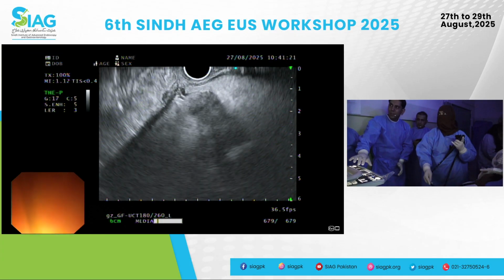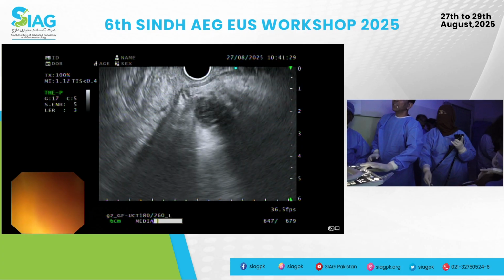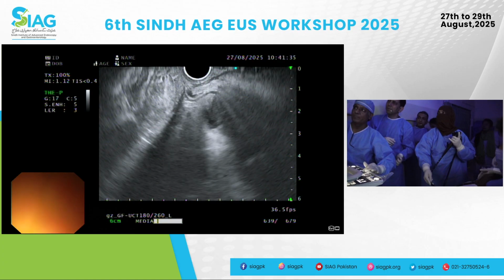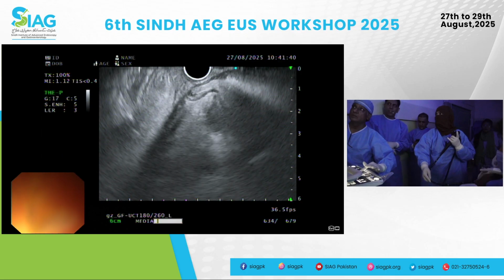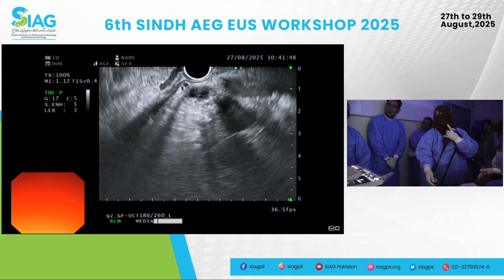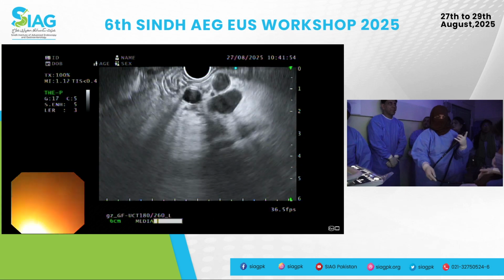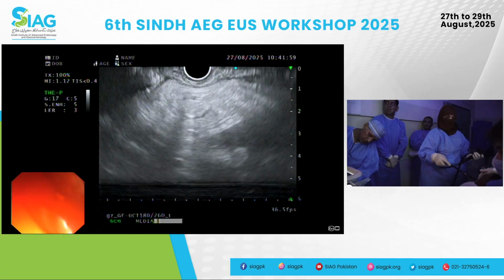Let me freeze there. What did you see there? Move it back a little, please. You briefly saw the stent. Oh, okay, sorry. Let's quickly go to the D1 in that case. Unfreeze it. We just had a brief look at the PD stent. That's fine. Let's go into the D1 then. Please enlarge the endoscopic image.